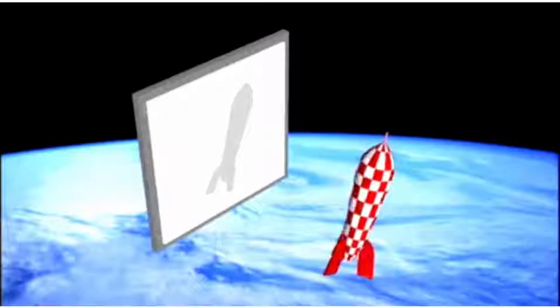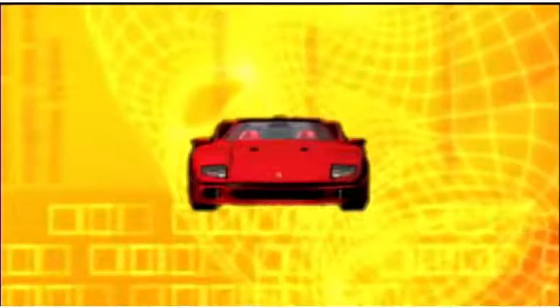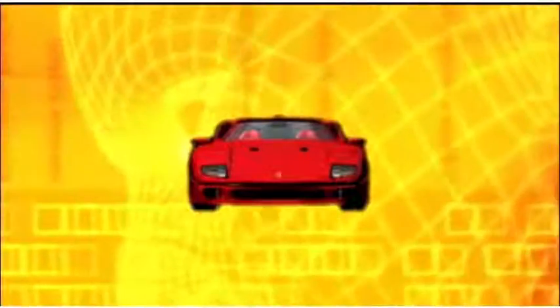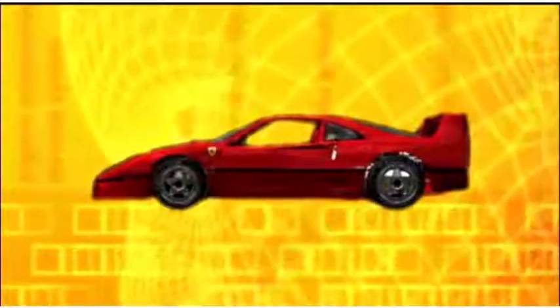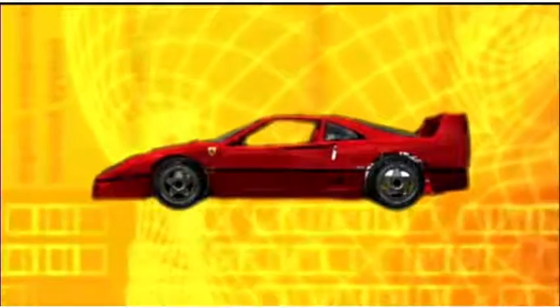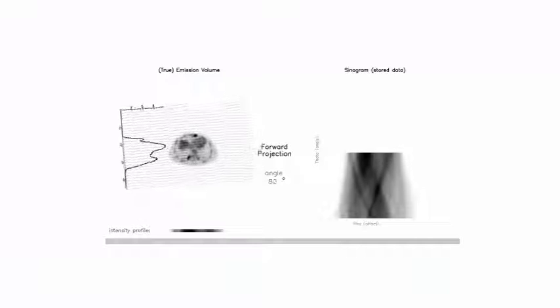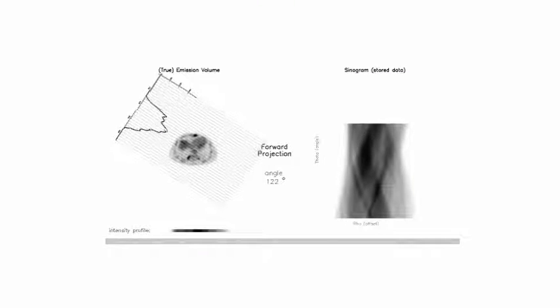Imagine we have a sphere and we take a picture of it from the XY axis. It will look like a circle, but we cannot know if it's a sphere or a cylindrical object. Then we could take a picture from the YZ axis and combine it with the previous picture. If the picture on the YZ axis looks like a circle, then we can say it's a sphere. This is the same process used in computed tomography.